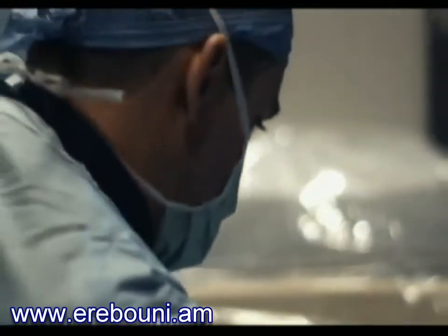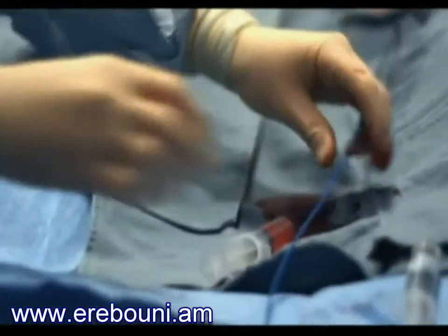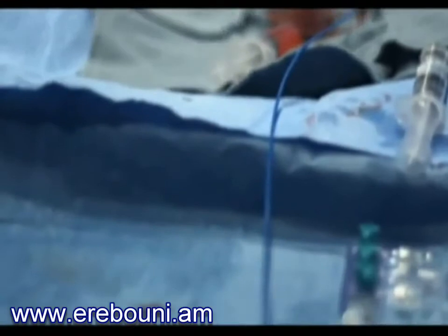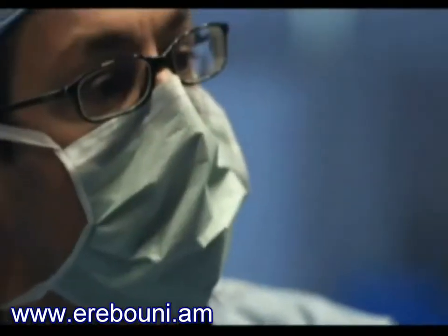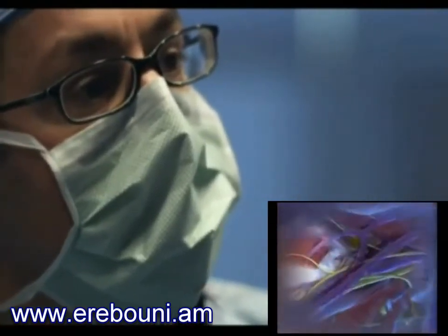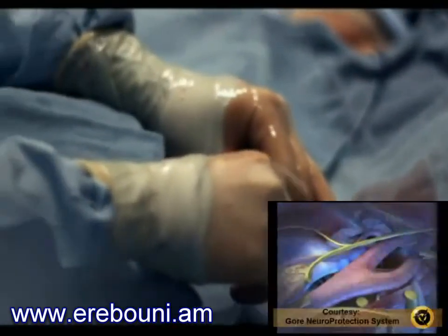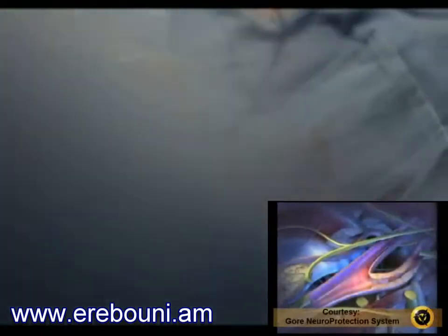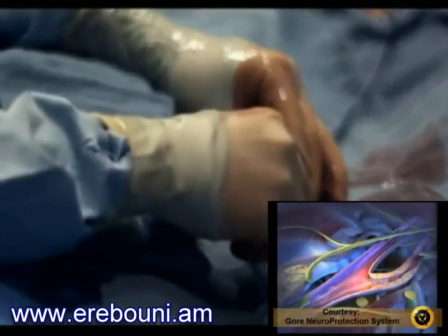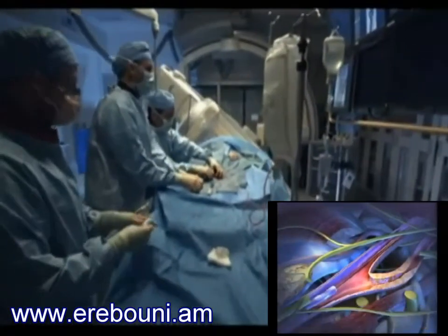Through a needle puncture in the groin or arm, the doctor inserts a catheter guided to the location via fluoroscopy. Next, a small wire with a filter near the end, similar in appearance to an umbrella, is placed beyond the blockage. This embolic protection device, or EPD, is inserted to catch clots or debris that may break away from the plaque during the procedure and cause stroke.